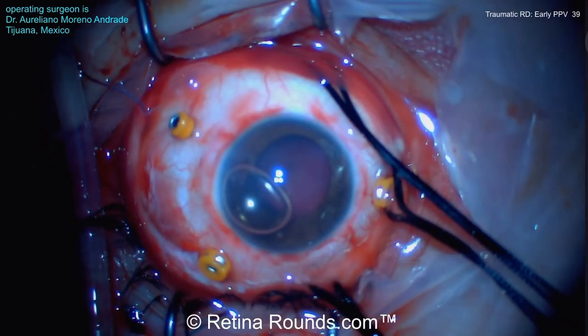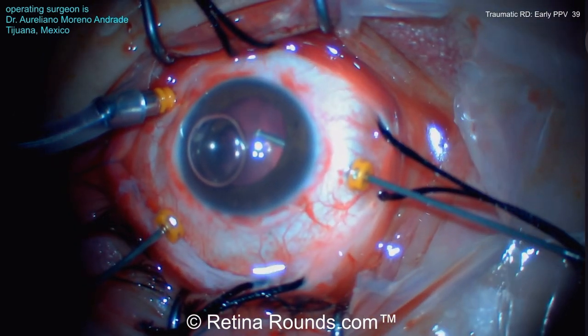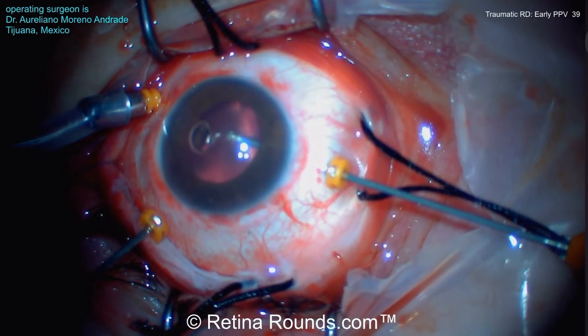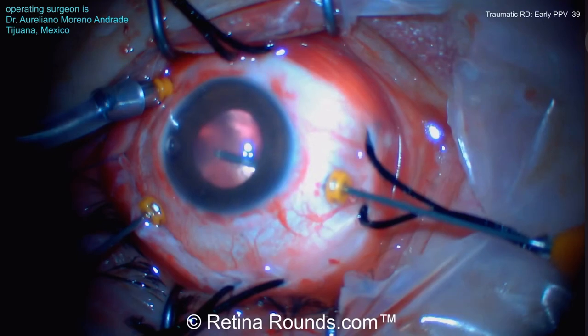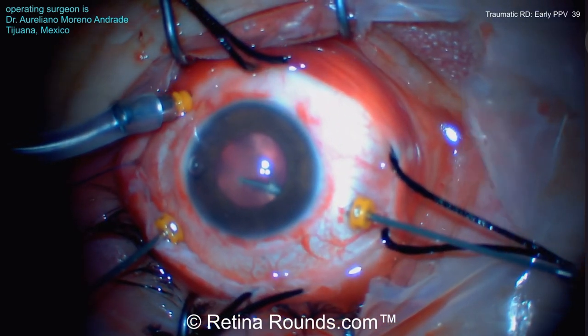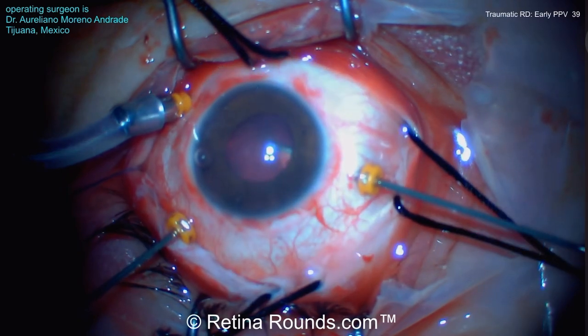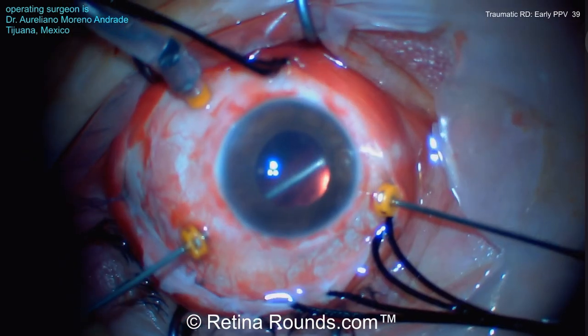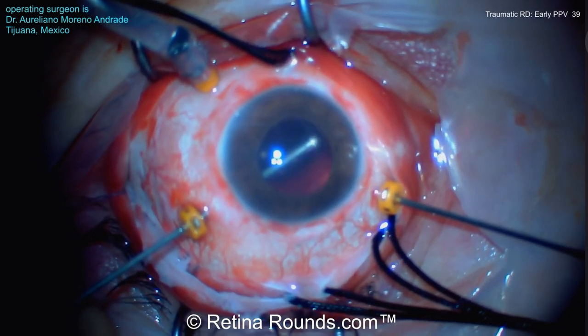And then once the other two trocars are in, the infusion line is then replaced into the inferotemporal quadrant where it normally would be. And again, this is a 6mm infusion cannula, which is a good idea to use in cases of trauma, since you want to make sure that the infusion cannula is fully within the vitreous cavity and not potentially infusing in the suprachoroidal space.